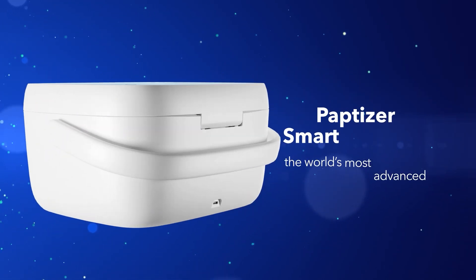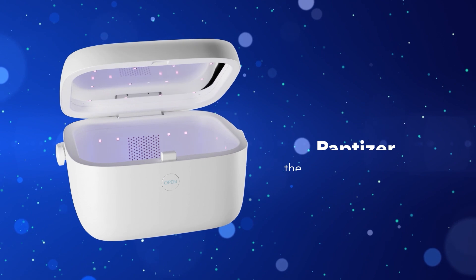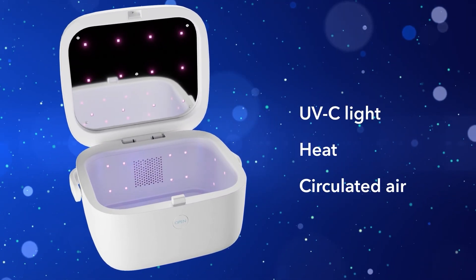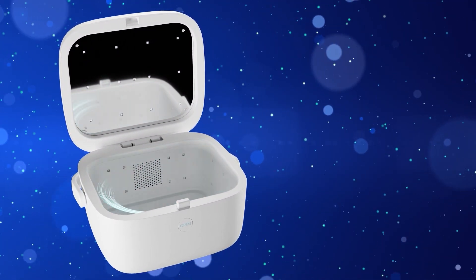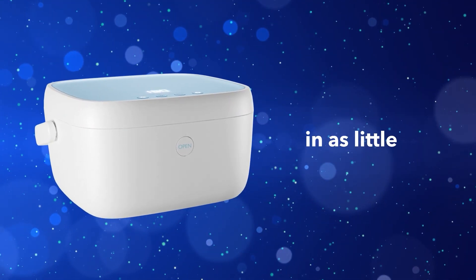Meet the world's most advanced sanitizing solution, the Paptizer Smart Sanitizer. The Paptizer utilizes UVC light, heat, and circulated air to eliminate over 99% of bacteria in as little as 3 minutes.